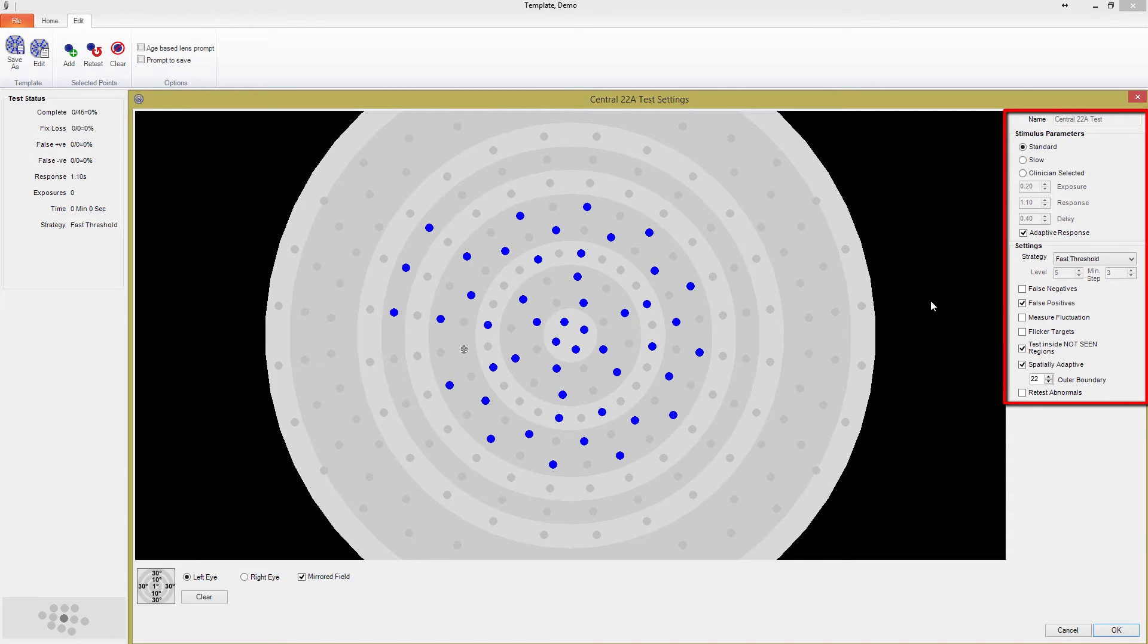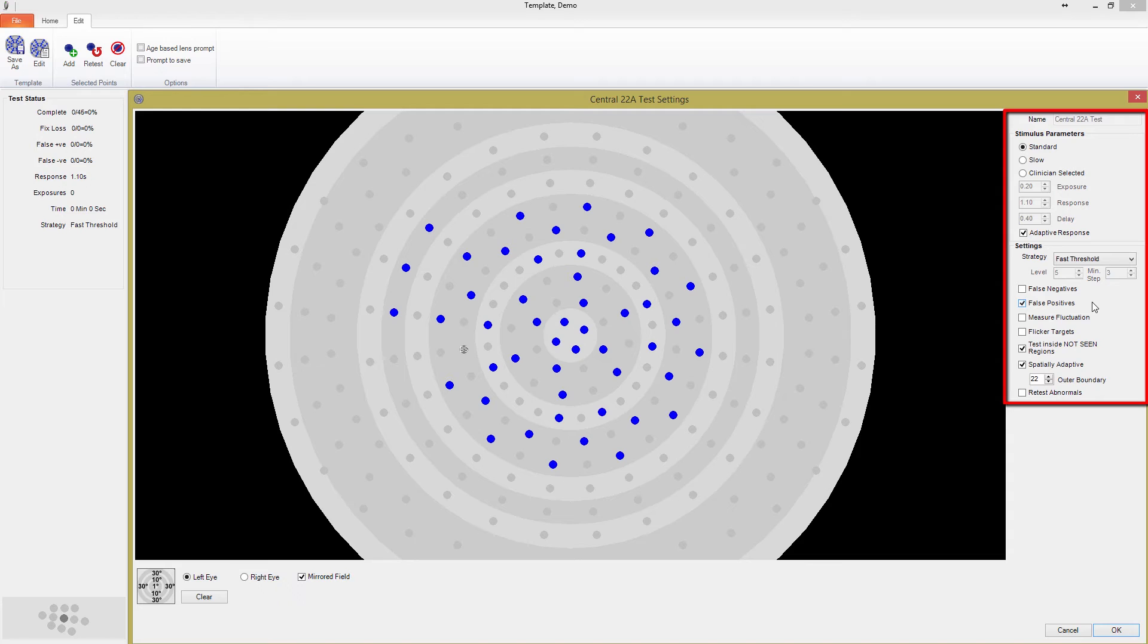The most common measure of reliability is false positives, which can be an important indicator early in a test. Because patients can get into a rhythm of responding, the software occasionally skips a point and exposes nothing for one exposure length of time. If a patient indicates that they have seen a point when it was never exposed, a false positive is recorded. This can be a powerful tool for technicians to immediately reevaluate and explain to the patient the importance of only pressing the patient indicator when they are confident they have seen a point.